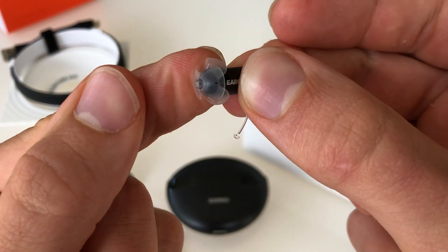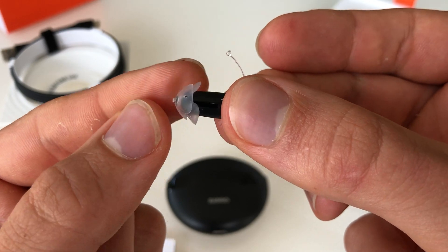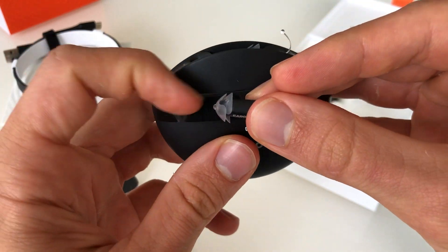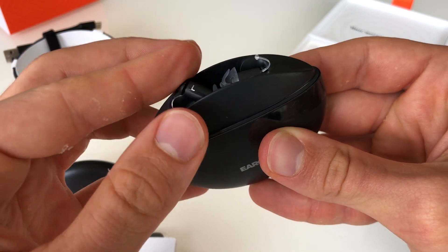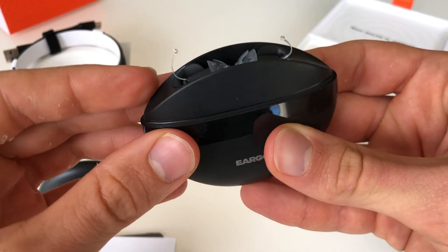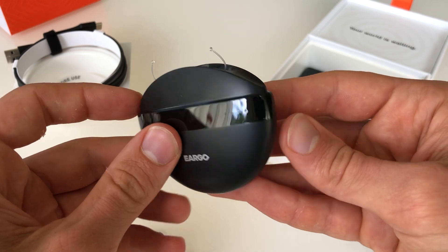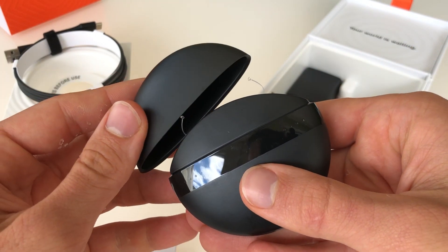And then you can see this piece here. The rubber tip has different layers, which add to the security and the comfort inside of your ear. Let's check how the case works. When I put this piece in with the fishing line piece up, that's how it should go in the case — just like that. And then it charges.